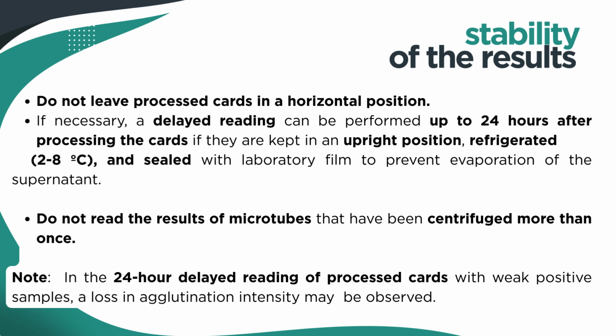Do not read the results of microtubes that have been centrifuged more than once. So you're not allowed to centrifuge it a second time. And in the 24-hour delayed reading of processed cards with weak positive results, a loss in agglutination intensity may be observed.